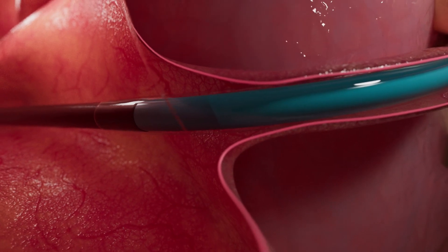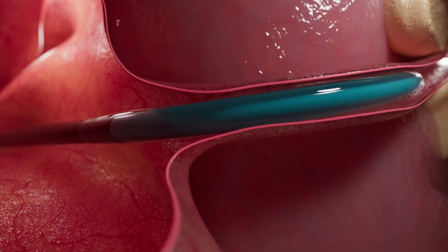The device features a 45-degree angle that serves to provide a positive stop that avoids critical anatomy.